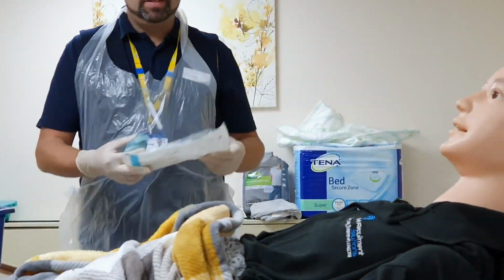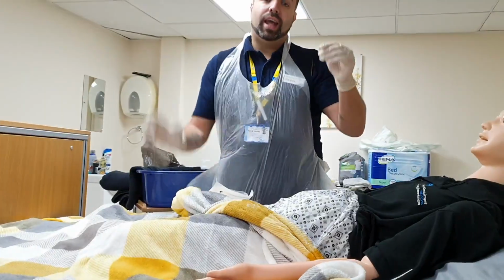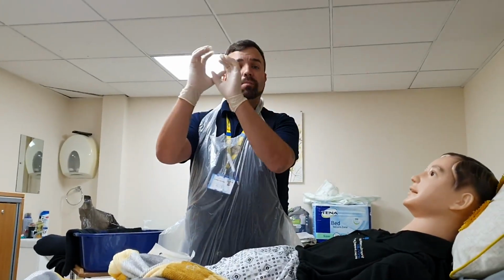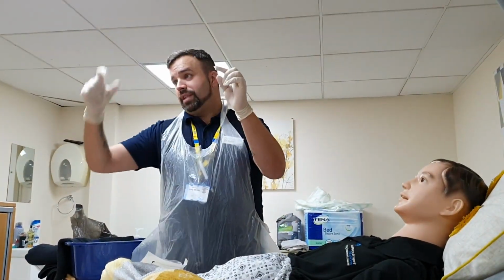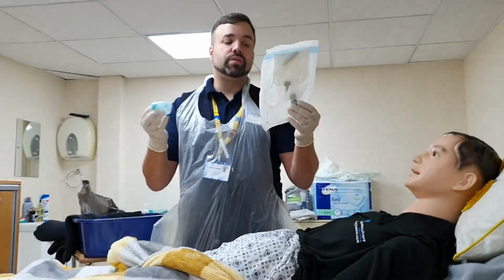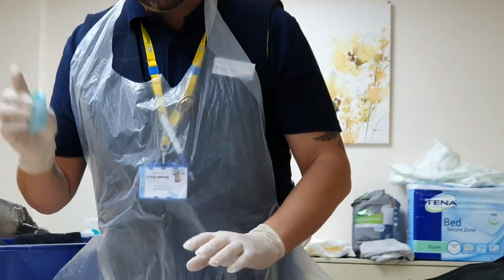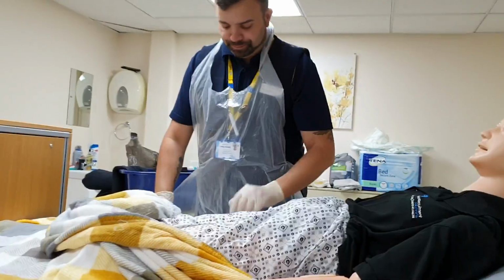There's two types of catheters. There's the catheter that goes down the urethra into the bladder, and it's like a little ball and it blows up. The urine comes down a tube into a catheter bag. Alternatively, we use the convenes for men because they're less invasive. So I'll just run through how to use the convene.